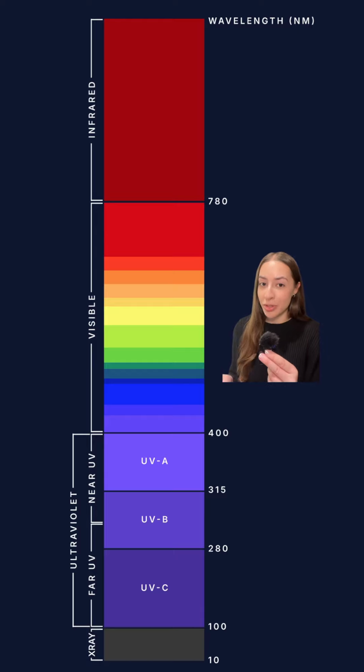What will give you better results, though, is using the right wavelength at the right distance and the right exposure time. And when it comes down to it, you're just more likely to get that from a single wavelength 254nm UVC device.